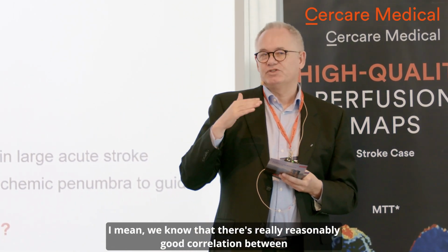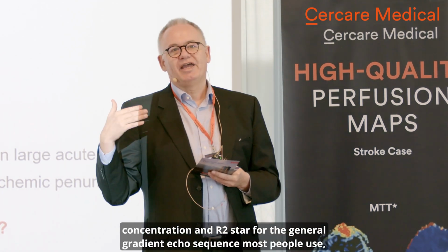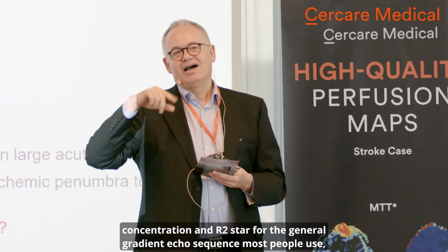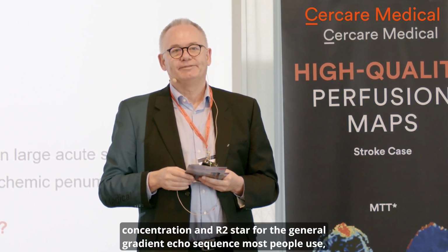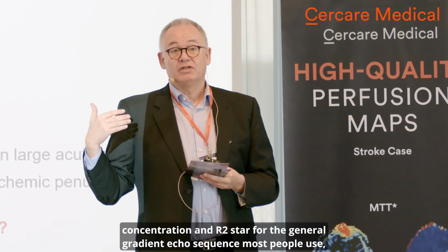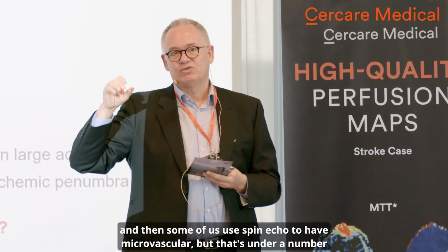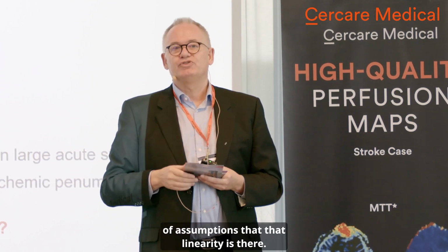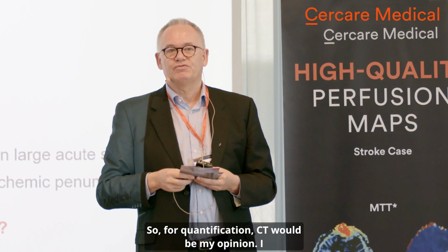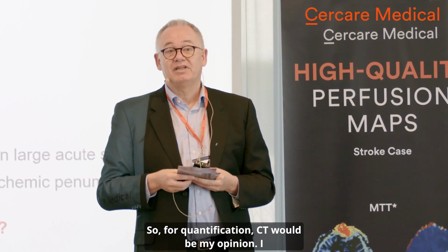We know that there's reasonably good correlation between concentration and R2 star for the general gradient echo sequence most people use, and then some of us use spin echo to capture the microvasculature. But that's under a number of assumptions that linearity is there. So for quantification, CT would be my opinion.